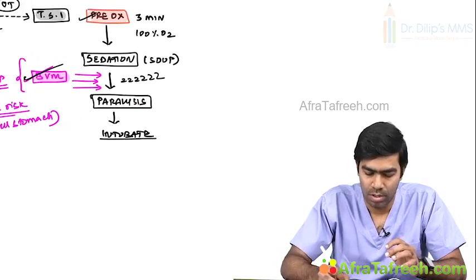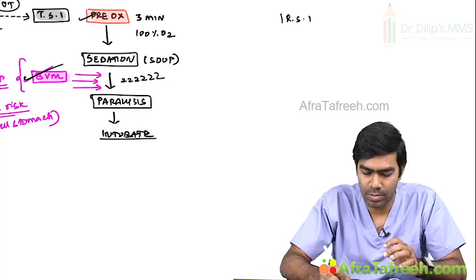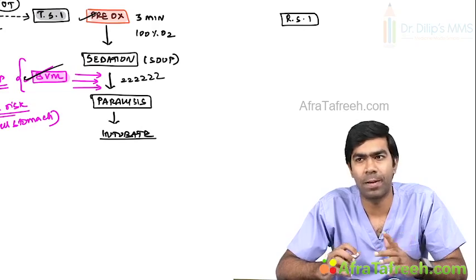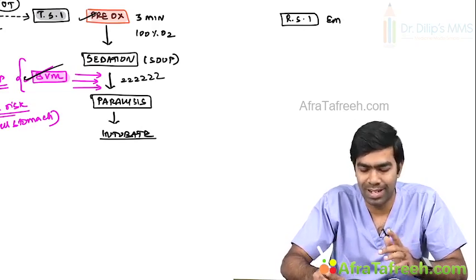Now, move on to the rapid sequence intubation, RSI. Rapid sequence intubation has some differences, but remember, it is done in emergency scenarios. Here you don't have time.